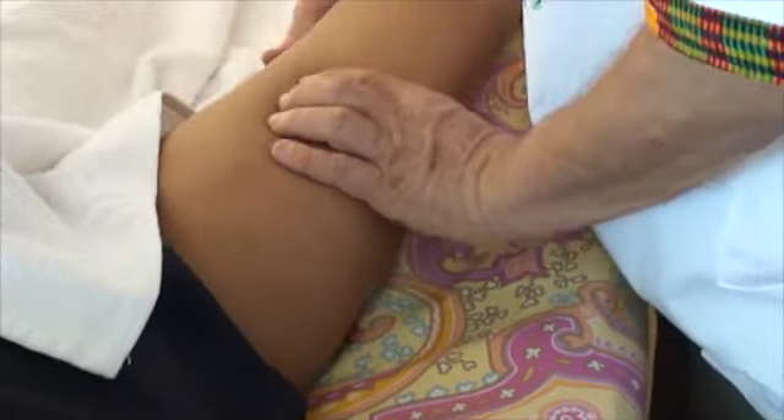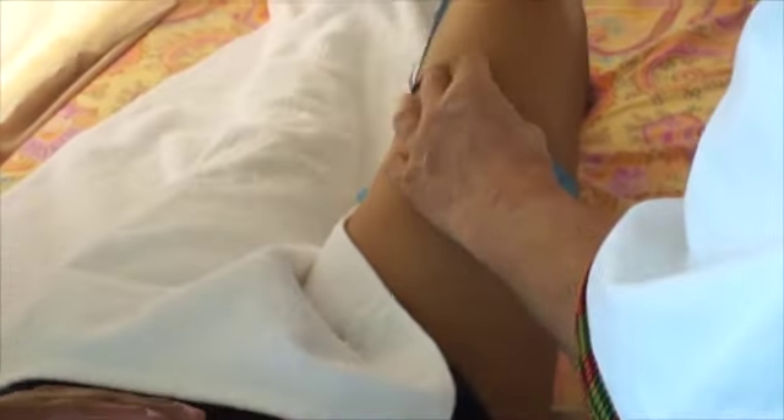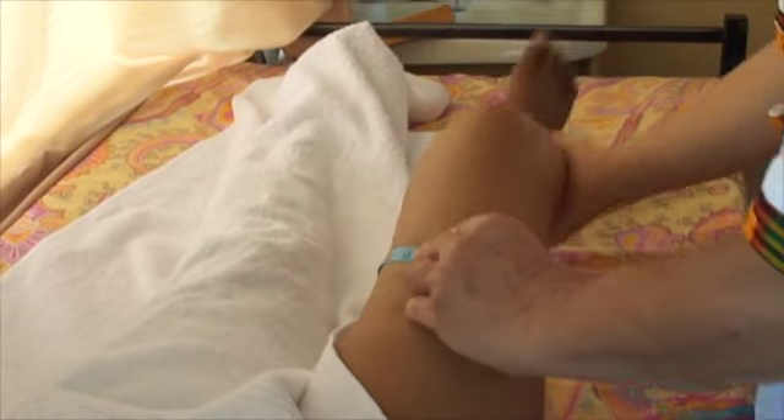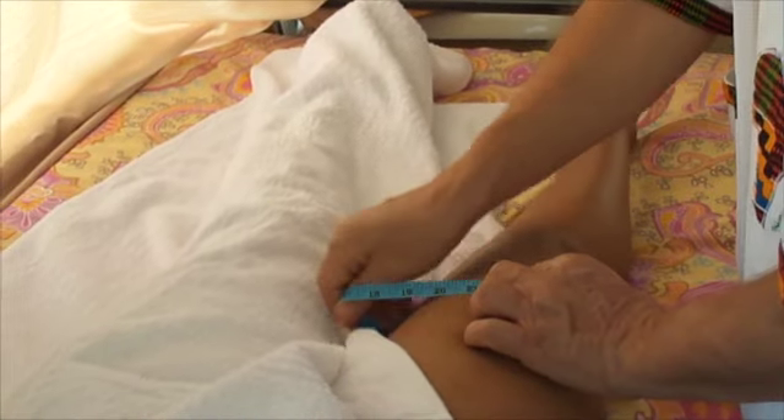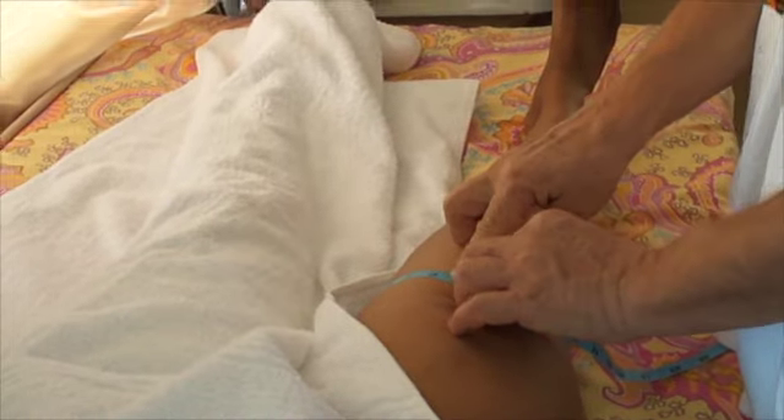Just flex your knee a little bit. So 10 cm distance from the kneecap, I will measure here.